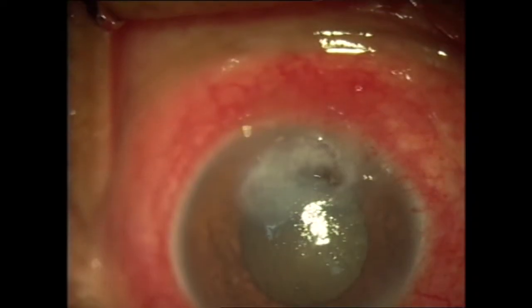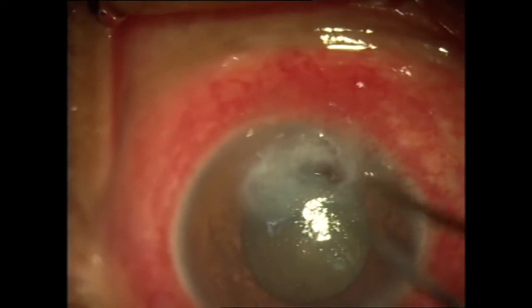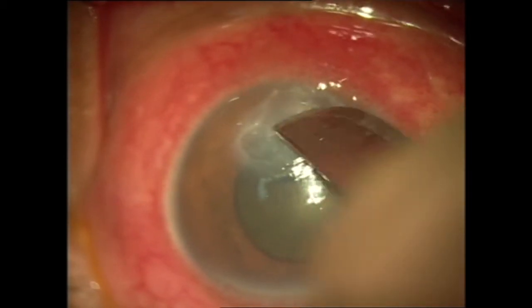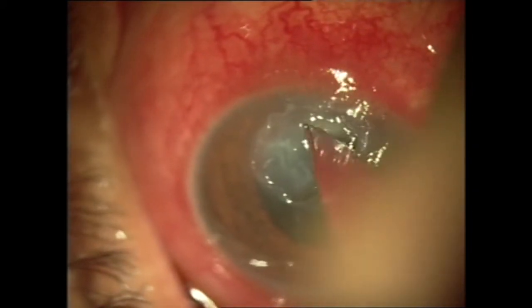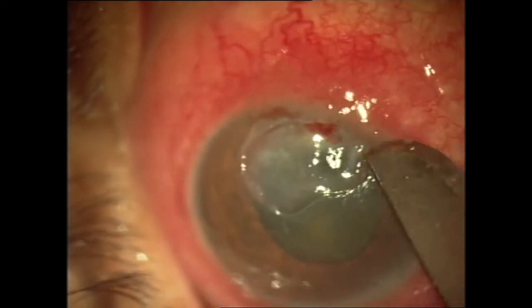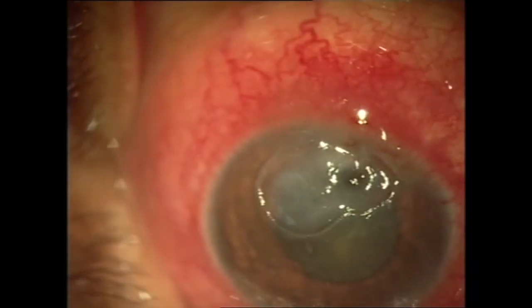A 56-year-old gentleman with lagophthalmos presented with persistent epithelial defect, corneal melt and descemetocele. The first step in application of the glue is meticulous removal of the loose epithelium and tissue debris. The loose epithelium is scraped off from the edges of the ulcerated area till a healthy stromal surface is exposed all around the ulcer. The necrotic stroma is removed from the ulcerated area.